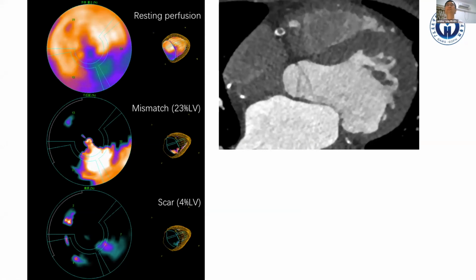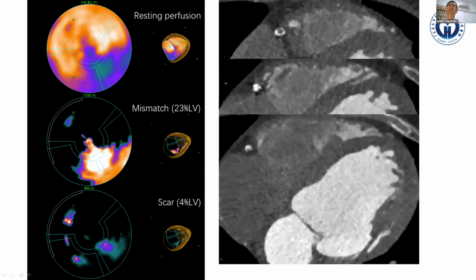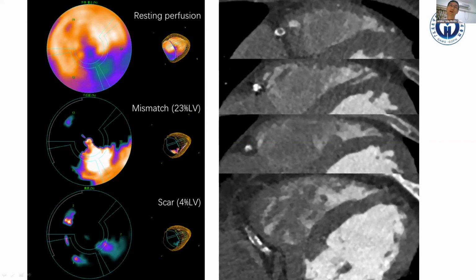Also, with the CT scan, we can see the right coronary over here. There is some calcium, like a circle around the vessel. All of us know that calcification is one of the difficulties for opening up a CTO in terms of the J-CTO score. But for me, sometimes the calcium, if it's just like this, like a circle over here, is a good thing. It can help me find out the course of the vessel and prevent the wire from going out of the vessel. But here, there is some nodular calcium, like a half circle. And here, the calcium is also distributed on the vessel wall.